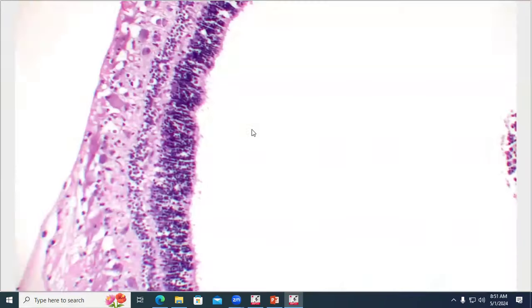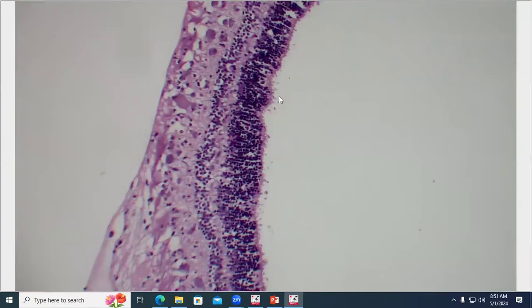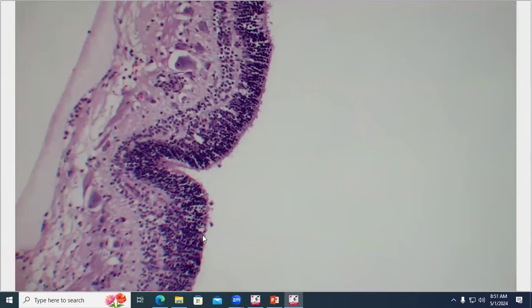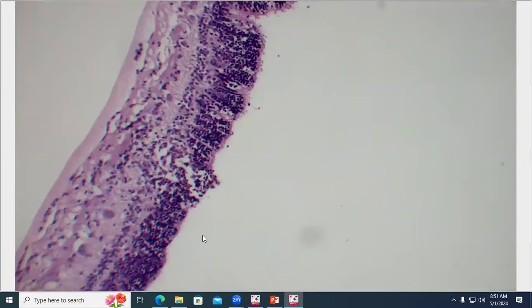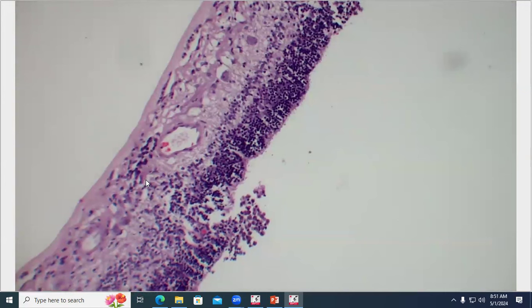Of course, there's the separation itself, but that can be an artifact. But the presence of cells underneath the retina, the atrophy of the photoreceptor segments, and sometimes you see macrophages just kind of nibbling at the photoreceptor segments there. These are all features of real retinal detachment. The retina is not normal by any stretch of the imagination because it is atrophied and detached, but there's a few lymphocytes and plasma cells in there, but it's not as severely inflamed as the choroid itself.